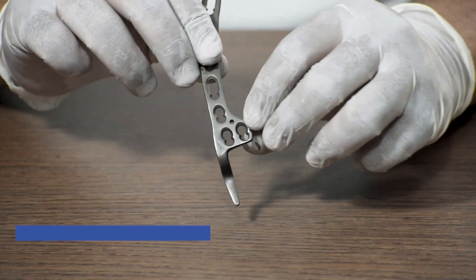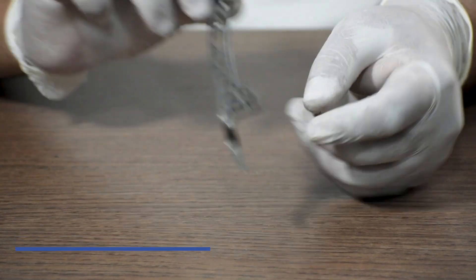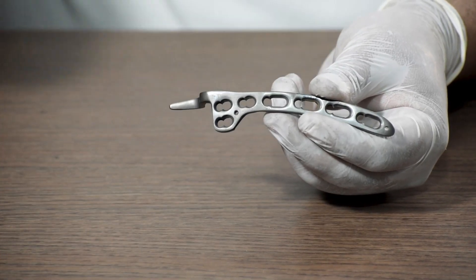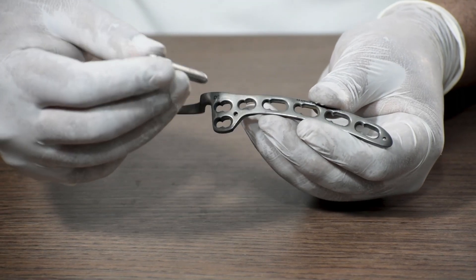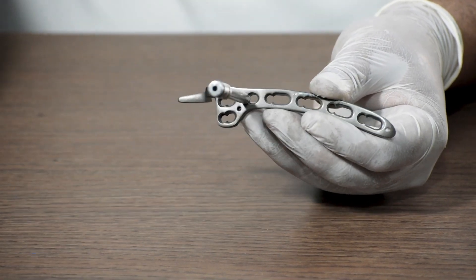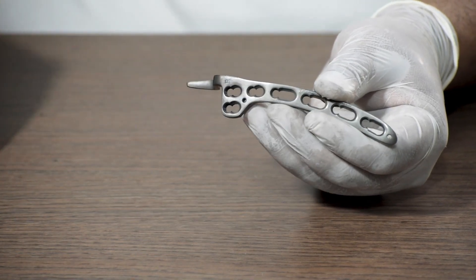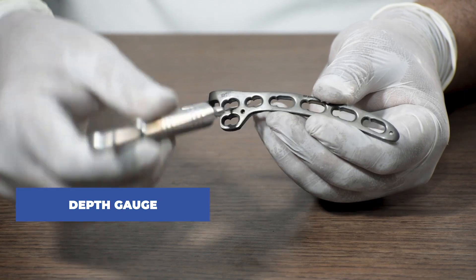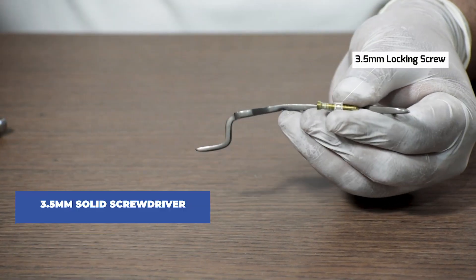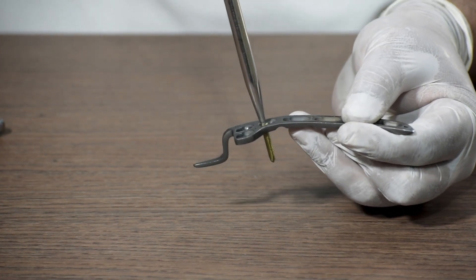Now lastly, the clavicle locking hook plate — also known as the acromioclavicular plate — available in both left and right side. We are taking a right side plate for this demonstration. This is an entirely 3.5 system plate. To fix a locking screw, we use a 3.5 mm locking drill sleeve, attach it in the locking hole, then use a 2.8 mm drill bit and drill through the locking drill sleeve. After drilling, we use a depth gauge to measure the length required, take a 3.5 mm locking screw, connect it with a 3.5 mm solid screwdriver, and fix it in the drilled hole.